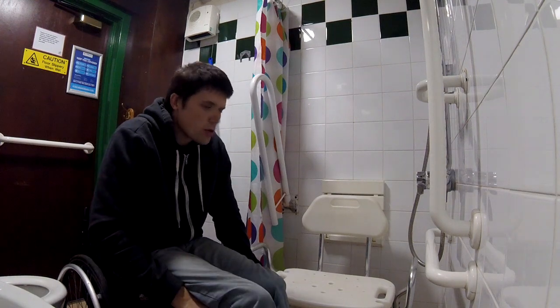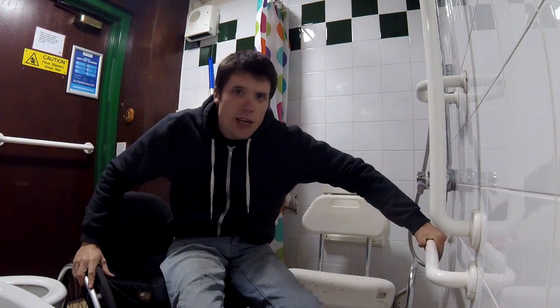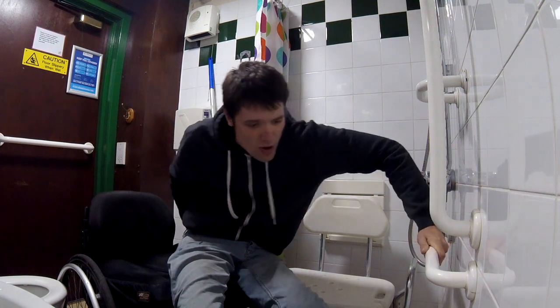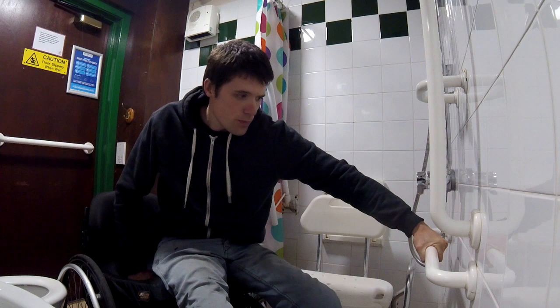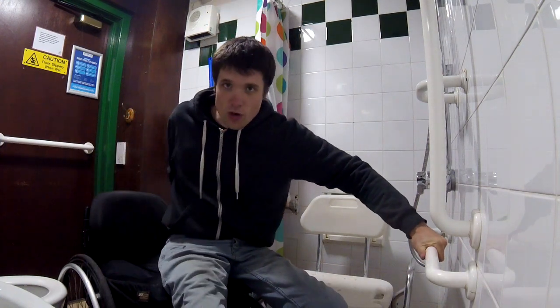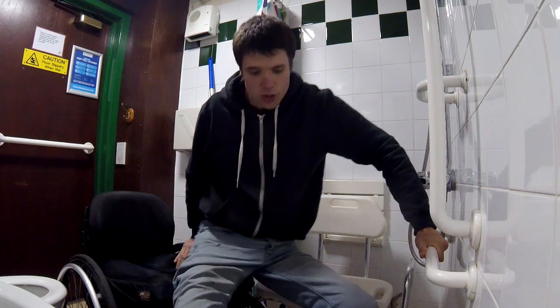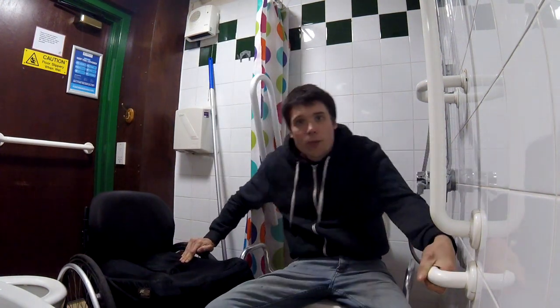You can also have bars in the shower, and these are facilities at a campsite in Scotland — absolutely fantastic. What you do here is grab the bar, move forward in your chair, grab your chair anywhere. I am grabbing it on the wheel just behind me. Lift, and lower yourself down.